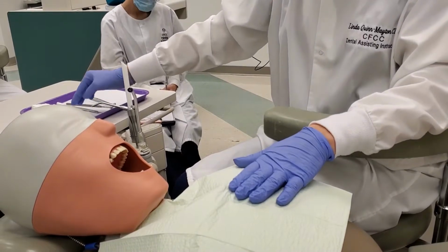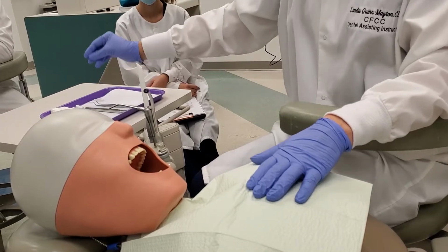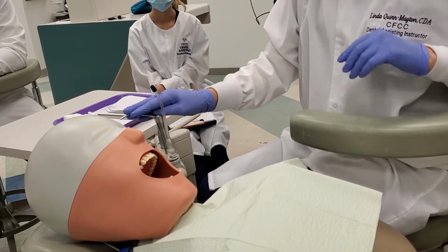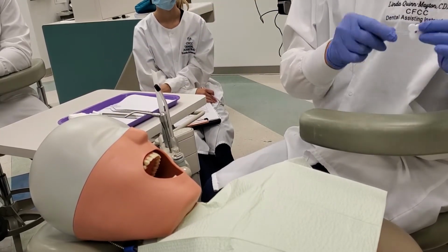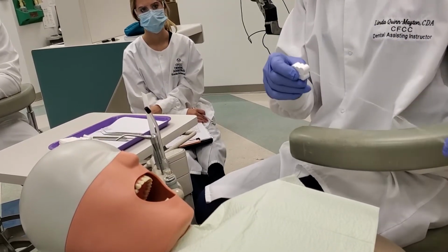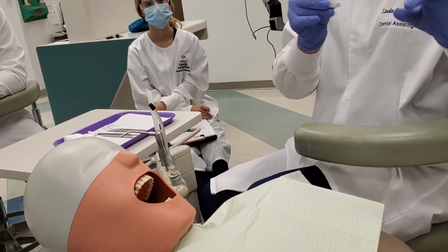the patient napkin, and the basic setup, which is your explorer, not really an explorer, but it'll do, the mirror, and the cotton pliers. You have cotton rolls. You have the disposables: your HVE tip, your saliva ejector, your air water tip, and then the safety glasses and the bite block. The reason you have the dental floss is to ligate the bite block. Anytime you're putting anything in the patient's mouth, a bite block, a dental dam clamp, anything like that, you need to ligate it in case it gets dislodged or becomes loose during treatment, so the patient doesn't swallow it and you can just fish it out. Ligating the bite block is part of your assessment also.